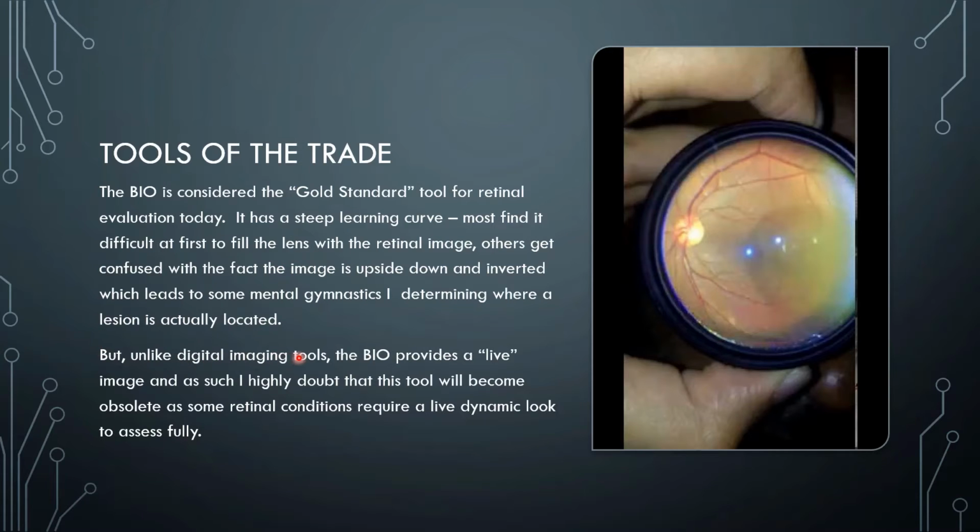Unlike digital imaging tools, the BIO provides a live look, and that's why I highly doubt this tool will become obsolete, as many retinal conditions require a live dynamic look to assess fully. Okay. All right.